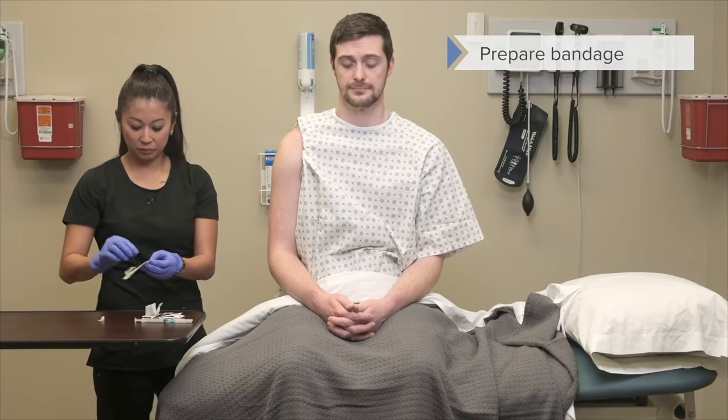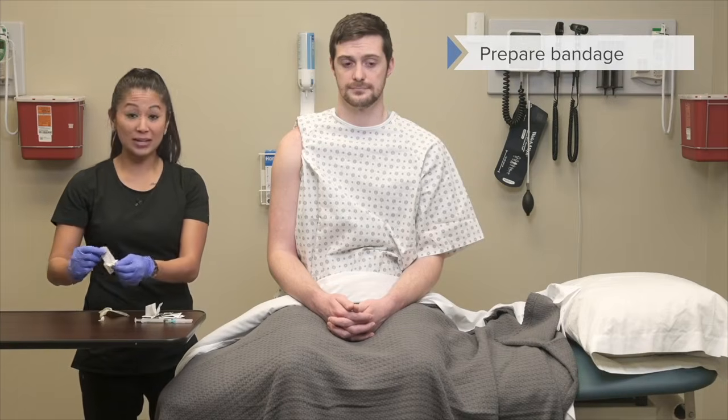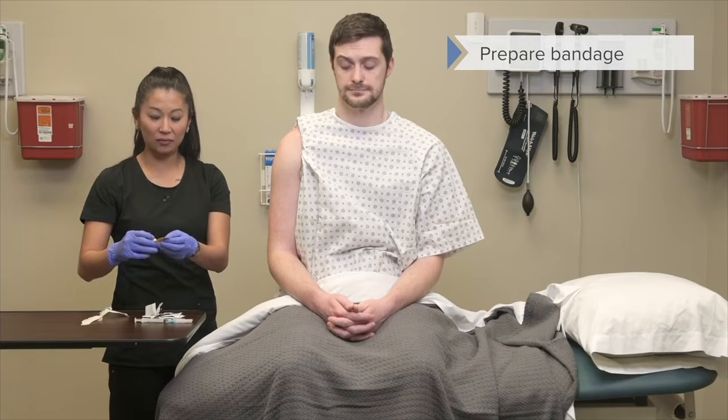All right, so now that I've cleaned, maybe your patient could bleed after you get done with the injection, so it's always great to have a Band-Aid ready. A great tip, you can even put it on the back of your glove, that way it's handy for you.